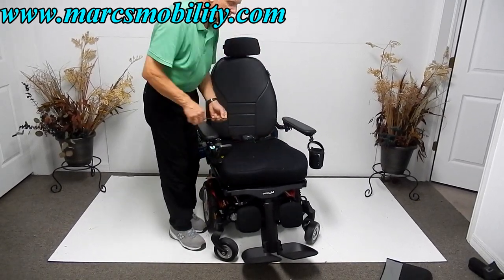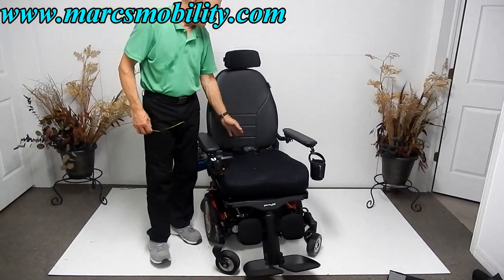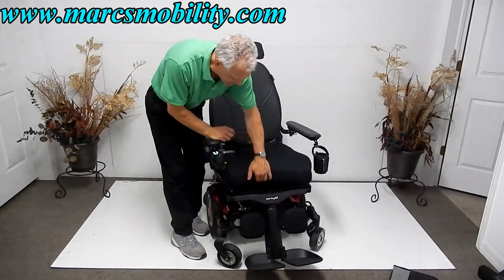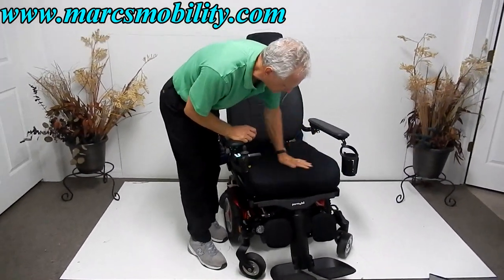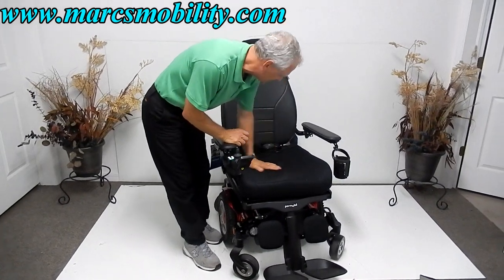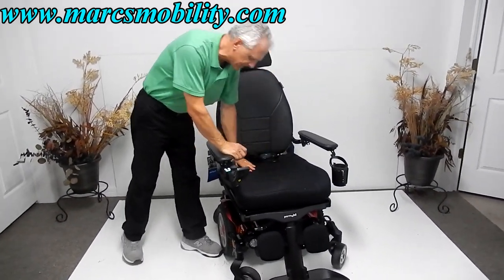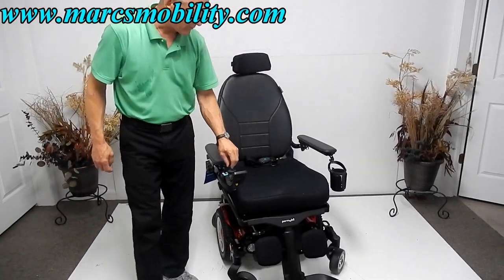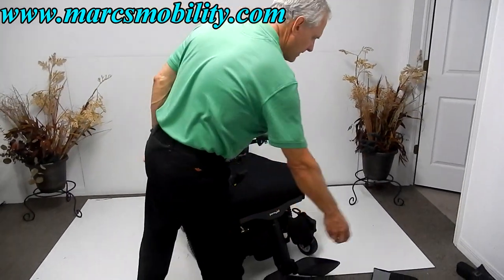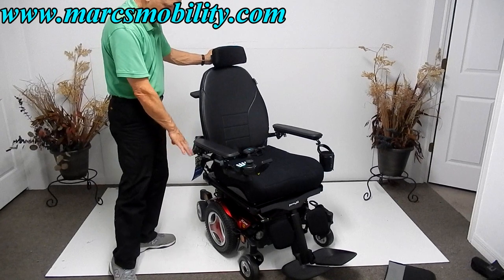The seat is actually 22 by 22, but we can move it forward if that's too deep — this is a removable seat and you can put any cushion you want on here. This is the cushion that came with it, a breathable cushion, with a leather back and breathable cloth cushion on the bottom. There's also a large adjustable headrest in the back.